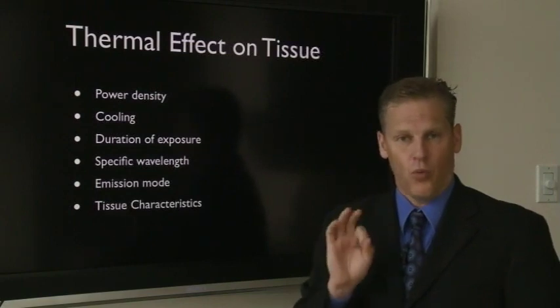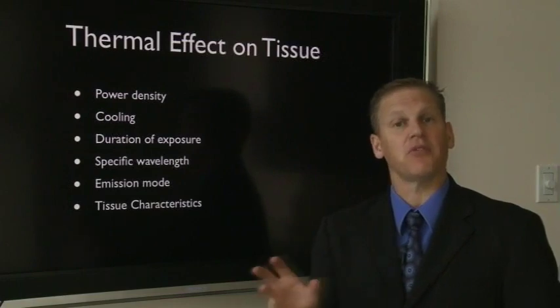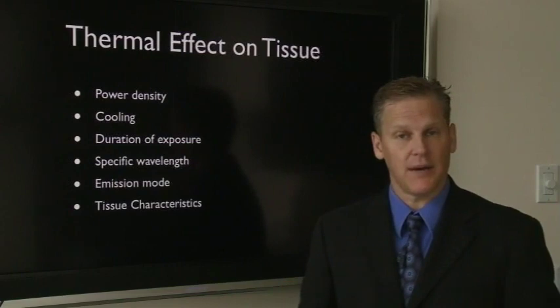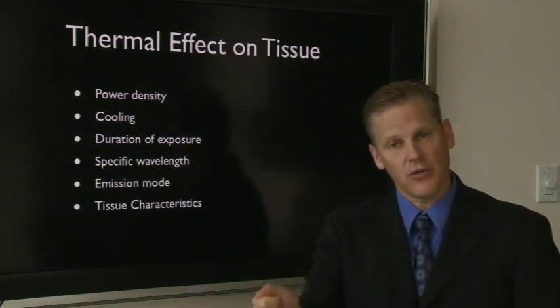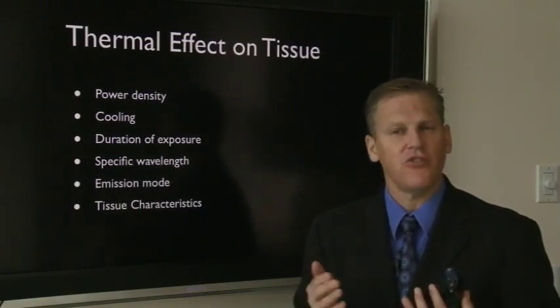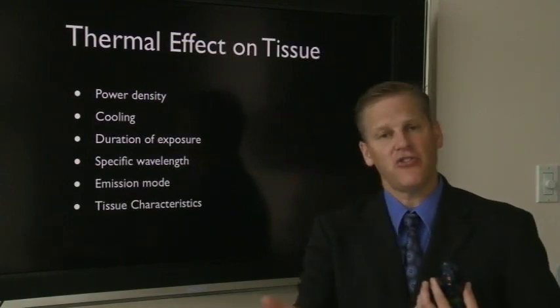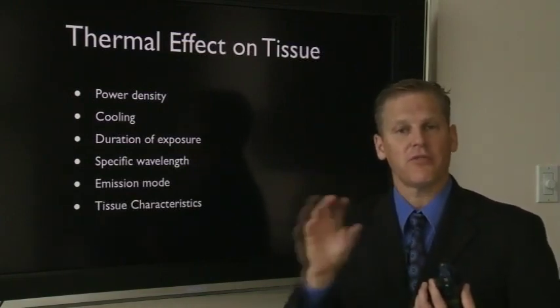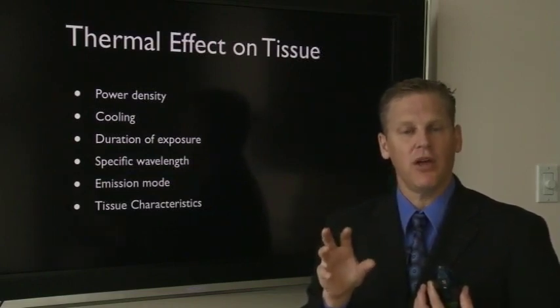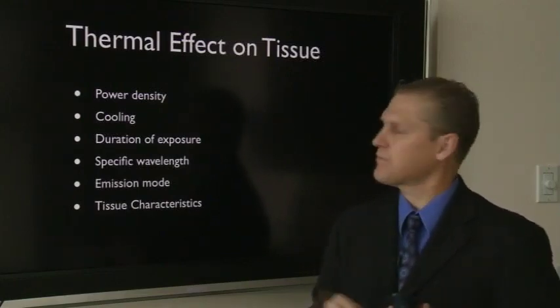Cooling. Cooling can happen through water. If you are constantly spraying water, you will cool the tissue down, but it will take you longer to cut. You may have less charring, but you may have more of a ragged cut. You can also cool with a stream of air, so it's effective if you're doing something like tissue recontouring, a gingivectomy without anesthetic, which is topical. If the patient's feeling it, just a gentle stream of air or some circulation of the air with high volume suction. Those two things will help you in cooling the tissue and perhaps decreasing the sensitivity.